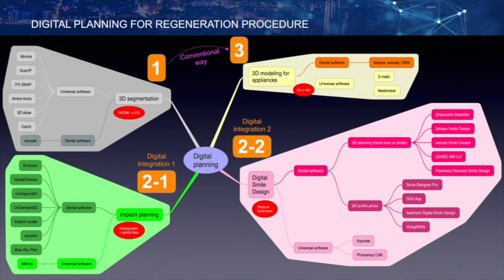Let's focus on digital planning. The most common procedure used in the medical field is from number 1 to number 3. However, in the dental area, there are various digital scans and they can be utilized additionally. If you want to use digital integration of various scanners, for implant planning and digital smile design, you can use dental software as shown like this.